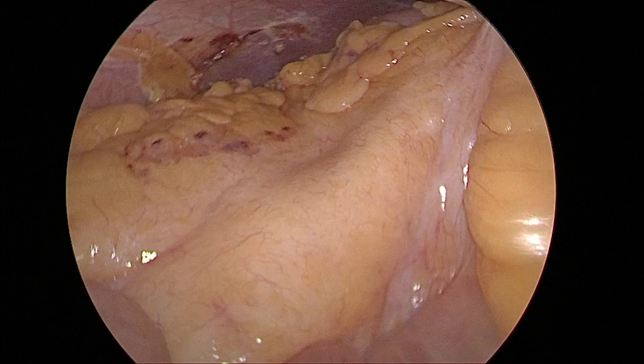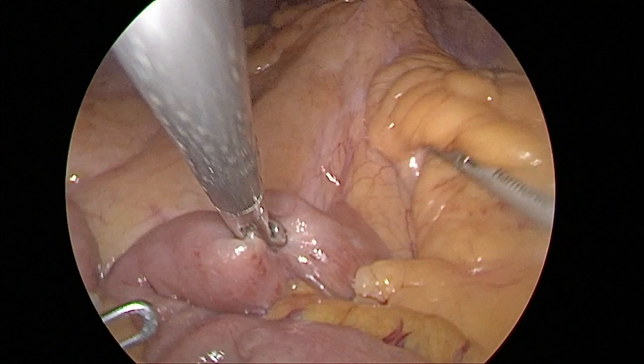In this case, confirming situs inversus totalis, the duodenojejunal flexure, angle of Treitz, and the mesenteric vein were on the right side in a mirrored image.